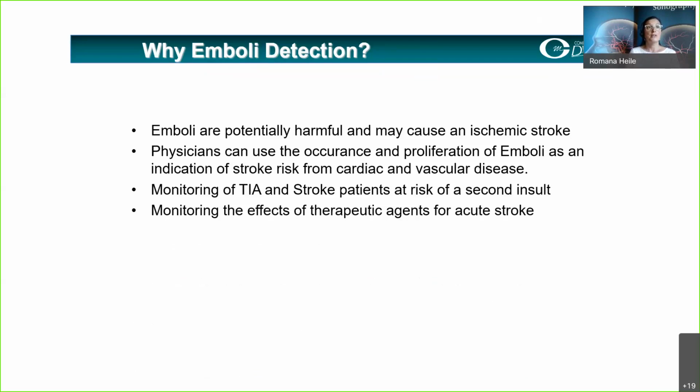Monitoring with emboli detection can also be used to see therapeutic effects. If, for instance, you have done a carotid endarterectomy, you can check later whether there is still a source of emboli. Emboli always mean an increased risk for stroke.